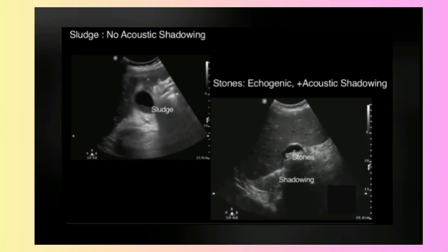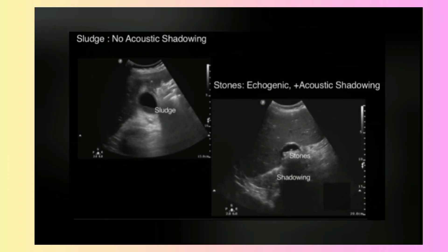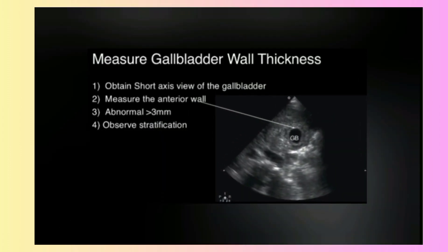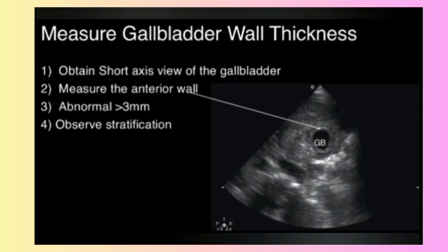First image: sludge — no acoustic shadowing. Second: stone — echogenic plus acoustic shadowing. Measure the gallbladder wall thickness.